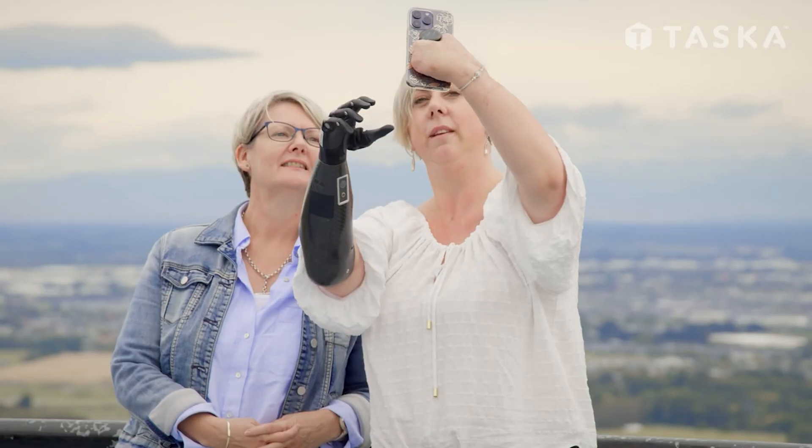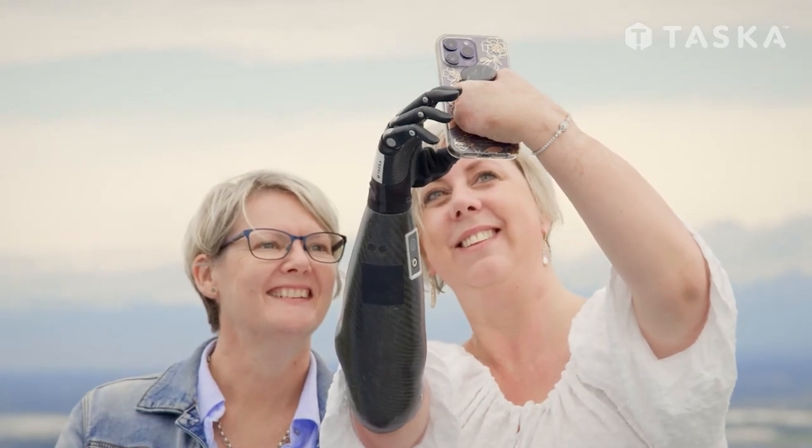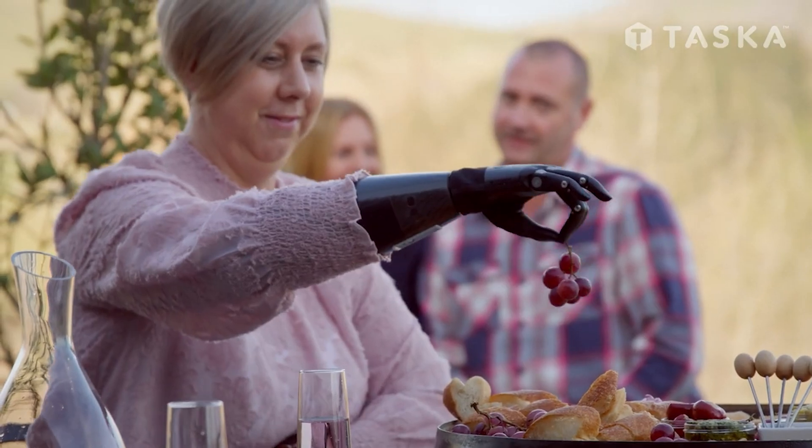Hi, I'm Doug from Taska Prosthetics. In this video we will compare the small and the new medium sizes of the Taska CX. The Taska CX is everything you've come to expect from a Taska hand and more. Not only is the Taska CX robust and reliable, it is also waterproof and easy to use. It makes daily tasks easier with intuitive control systems that allow for fine control, and it gives users an enhanced sense of connection through its contoured aesthetics and personalisation features.